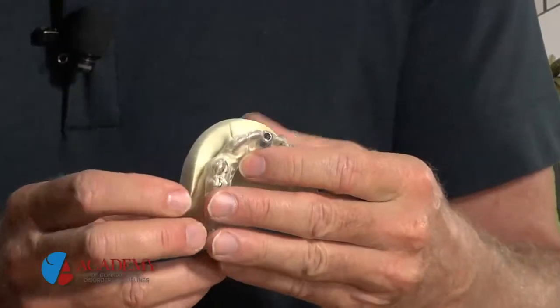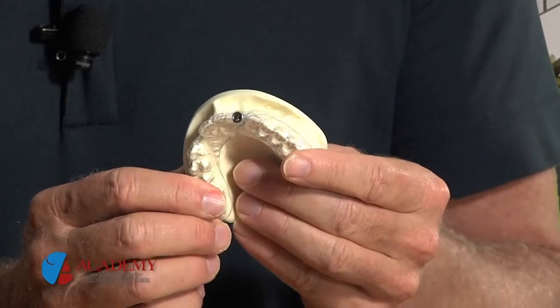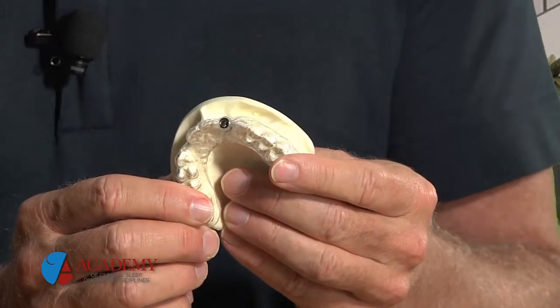The typical implant procedure itself is usually not that difficult, especially with three-dimensional planning. The great thing about this three-dimensional surgical guide is that there are no sutures or uncovering of tissues. It's just done through a little punch, like I showed in the guide. It's kind of like open surgery for a gallbladder versus arthroscopic surgery, which is so much less invasive.